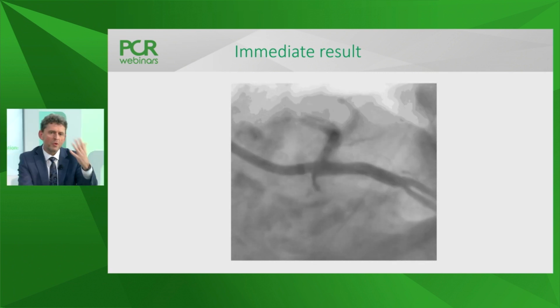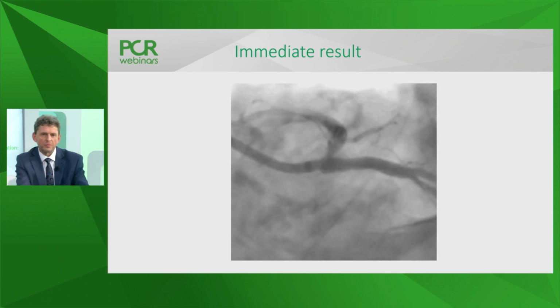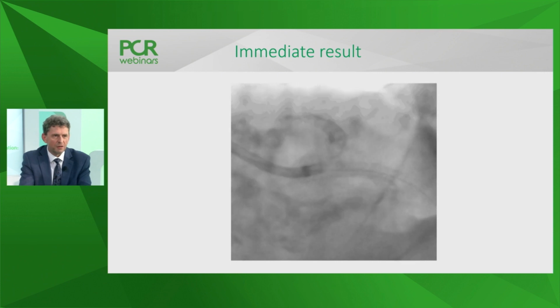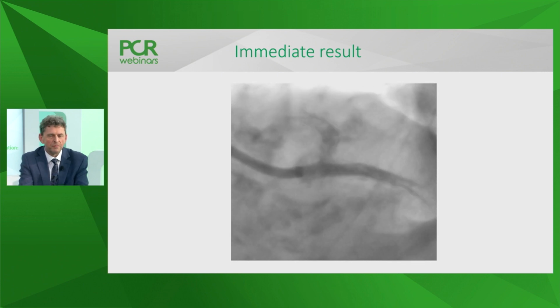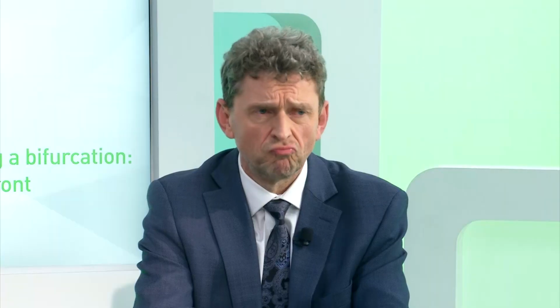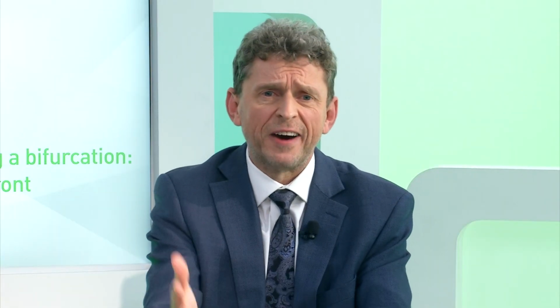We may rewire abluminally the stent and then create some mess of the wires in the vessel. So I strongly recommend to do the POT even without IVUS. So next step, POT as a mandatory step. Yeah. Tom? We can discuss the final POT in this complex technique. But first POT after deployment.